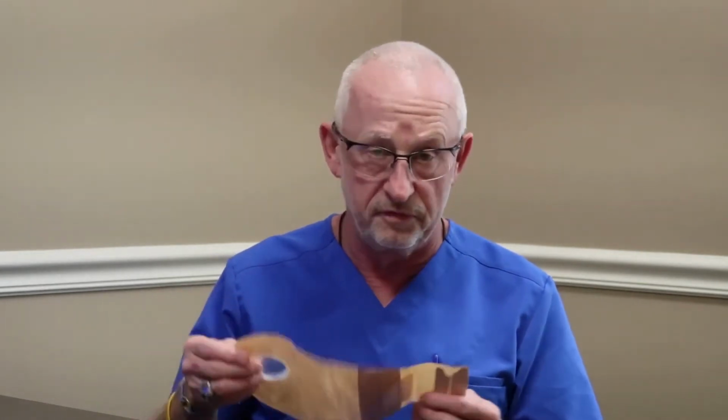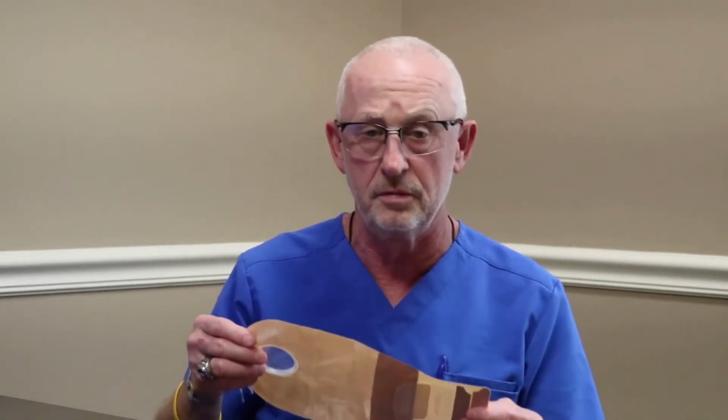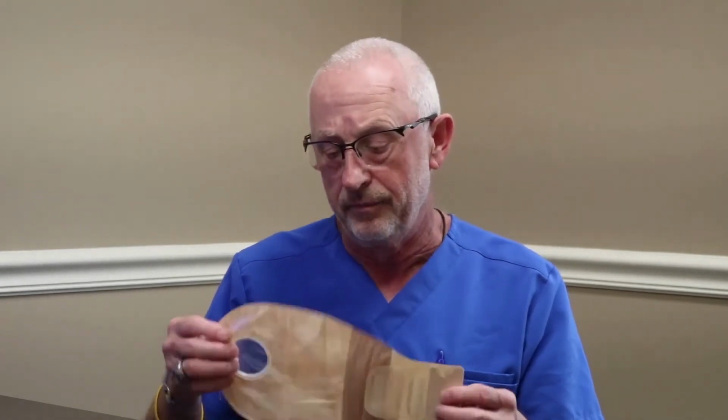Now, there are many different types of bags and appliances, but it's going to be attached to your abdominal wall, and you're going to collect stool here. So you can probably use your imagination and think of all the different things that can happen. I know I mentioned before that people can pretty much carry on a normal lifestyle with an ostomy, but you've got to make some adaptations. Obviously, the bag is going to fill up, and it needs to be emptied. So you've got the whole issue of going into a bathroom and emptying the bag, and most of these bags are reusable, and perhaps rinsing it out and putting it back on. That's different, and you have to learn to do that.